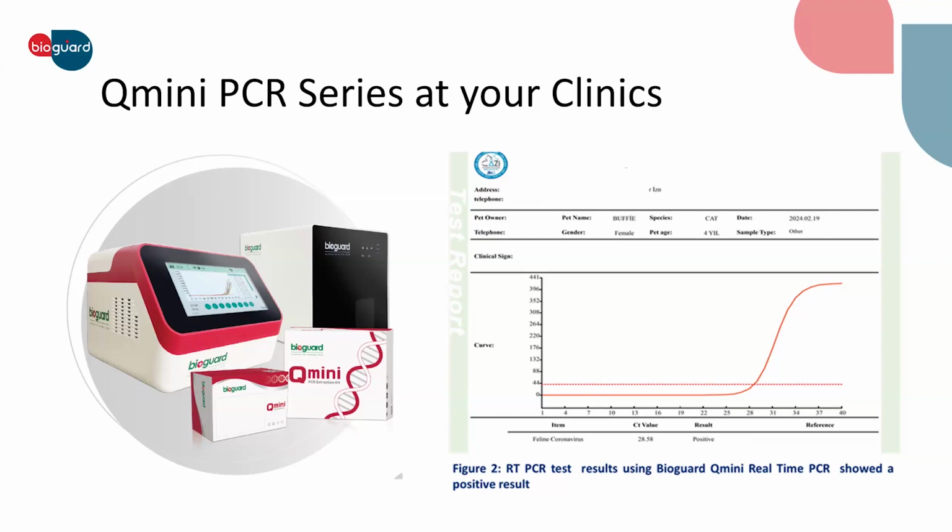Molecular tools like these help to support diagnosis when signs are unclear, confirm or rule out infectious causes in complex cases, and guide treatment or isolation decisions. When used alongside histopathology and IHC, molecular diagnostics bring us one step closer to precision medicine, offering a clearer, more complete picture for better patient care.